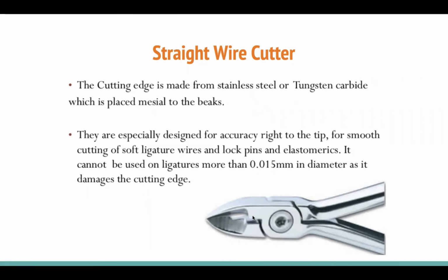If you use the straight wire cutter to cut the main arch wire, you end up damaging your cutter. And if you try to use the distal end cutter to cut the ligature wire, you end up spoiling and bending the wire, because that thin wire can't be cut with the distal end cutter. So you have to buy both of these cutters, the straight cutter and the distal end cutter. And you need to know when to use each.